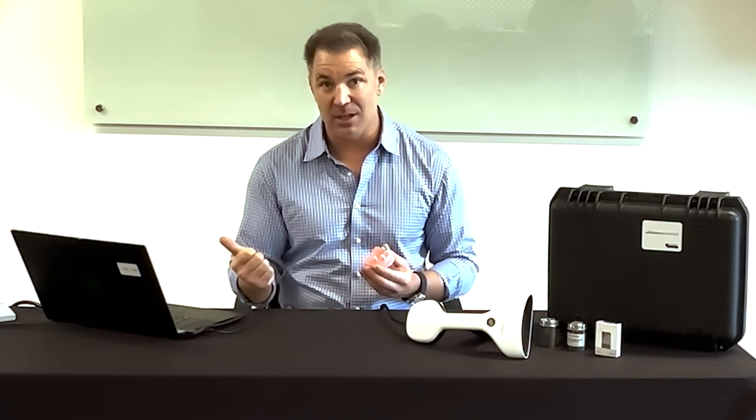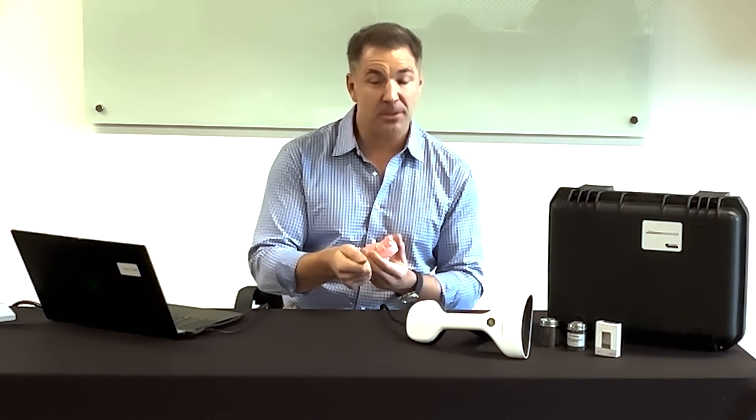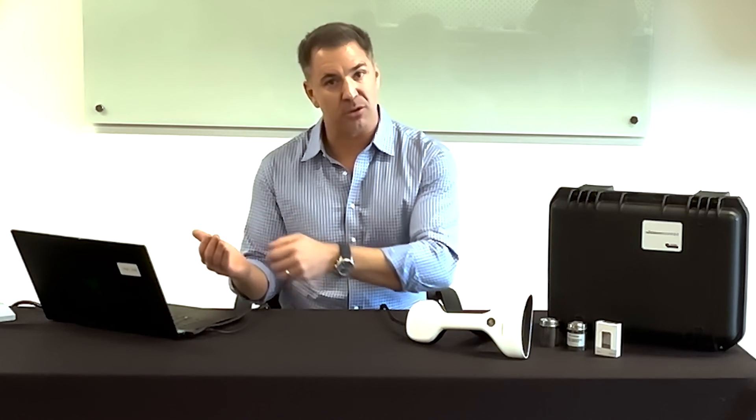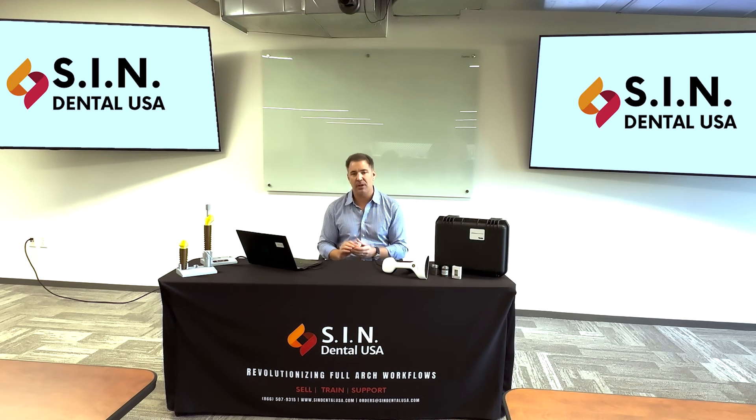For power users, there's also the ability to capture a soft tissue scan via alginate compression while the patient is still flat. This is important for medically compromised patients under anesthesia who have a limited window. Once surgery is complete, you put the multi-units on, attach the Micron Mapper photogrammetry scan bodies, take the photogrammetry scan, then take an alginate at bone level while the patient is flat. Scan the alginate with an intraoral scanner, send it to the lab, and instruct them to add two to three millimeters of tissue pressure. It's a power user feature that gives you great flexibility.